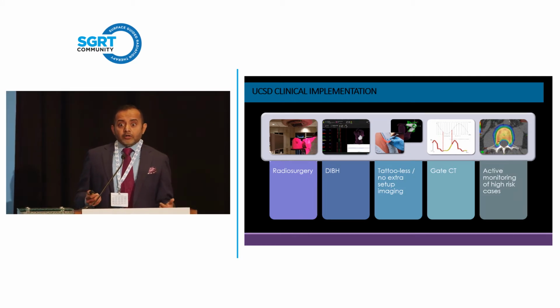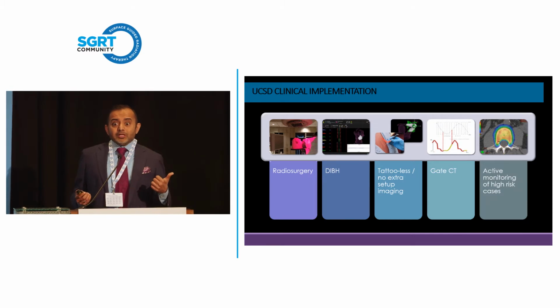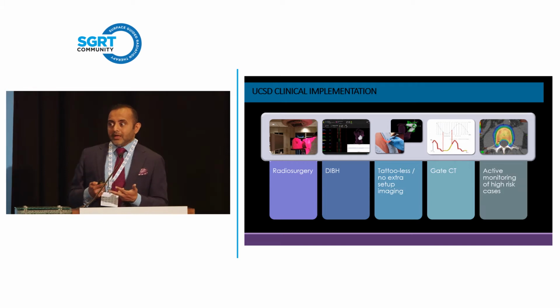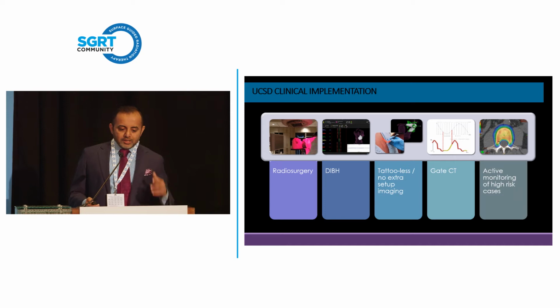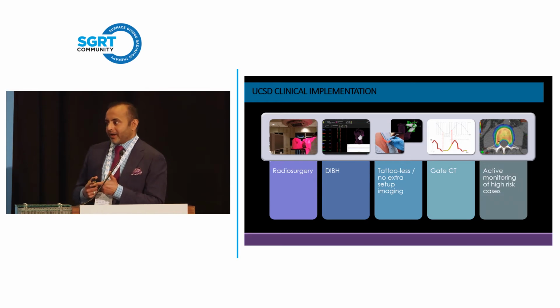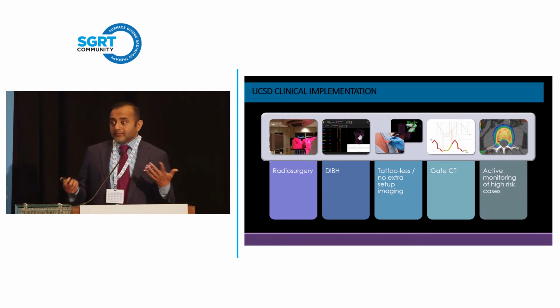And the frame mattered. Not only did it provide good immobilization, it really was your motion management system. Back then, there was no image guidance on the machines, and so there was certainly not intrafraction motion management system on any of our platforms. So when we started with Vision RT in literally 2009, really our goal was to see how do we make patient care comfortable in the radiosurgery world. And the first thing we all agreed on was getting rid of that damn frame. It's a pain for the patient. Literally, it's a procedure with risks of infection, bleeding, all those things. It's not comfortable, and the treatment takes a long time.